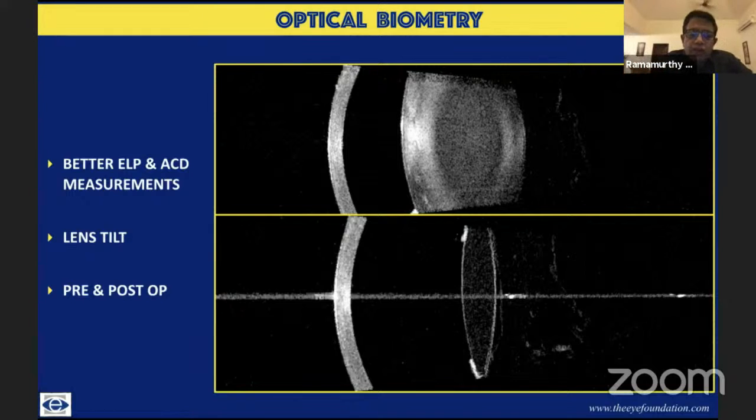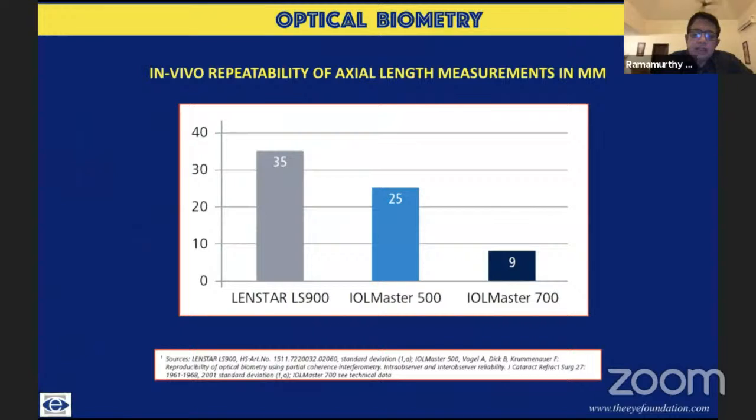And this is supposed to have an impact as far as the astigmatic outcome is concerned. And work is on to incorporate this as far as the exact orientation of our intraocular lenses is concerned in the toric intraocular lenses. This is work in progress, but suffice it to say that if a significant tilt is noticed, then these cases may be ruled out for premium intraocular lenses.